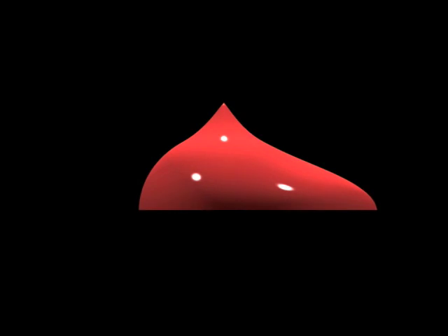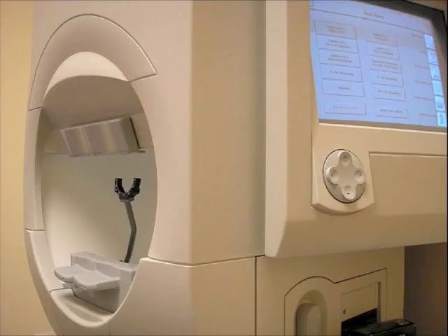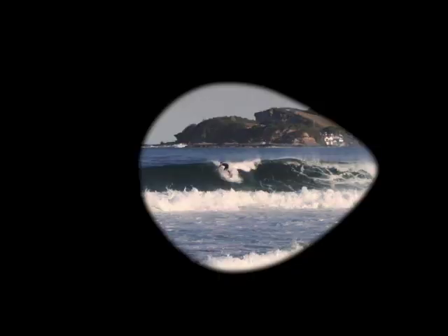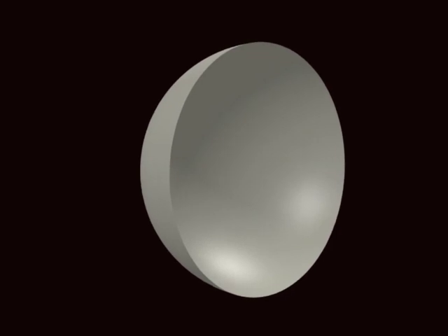Two machines are in common use in the UK to assist with this. First is the Humphrey Field Analyzer, second is the Goldmann Visual Field. Both machines sit the person's face inside a bowl of uniform light. The Humphrey machine typically only measures the central 24 or 30 degrees of field. One eye is covered, while the other fixates upon a central target. Lights of various brightness are shown across a grid pattern within the bowl until the threshold for detection of the light is established at each point. When the person sees the flash of light, they press a button.